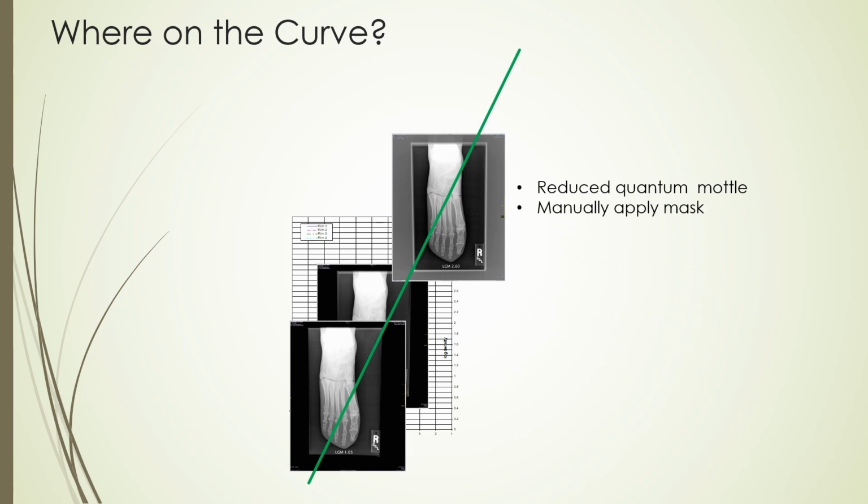Due to excess scatter radiation reaching the imaging plate, the computer didn't properly mask the final image. This problem can be rectified by manually adjusting the mask. A repeat exposure is not necessary, but a competent radiographer would recognize the overexposure and make proper adjustment of technique for future exams.